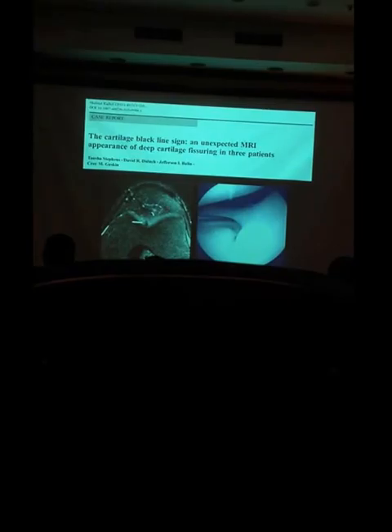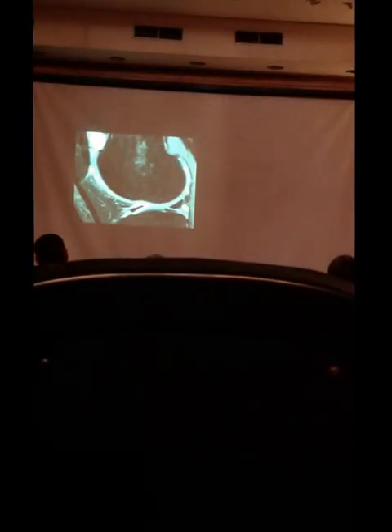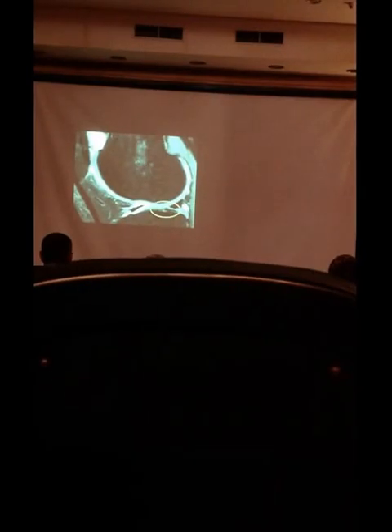Often this is nothing. The surgeon goes through arthroscopy and cannot find anything. Another example of this black, very low signal change within the substance of cartilage: we see one here in the central posterior region of the lateral tibial plateau, and we see another here, more linear.